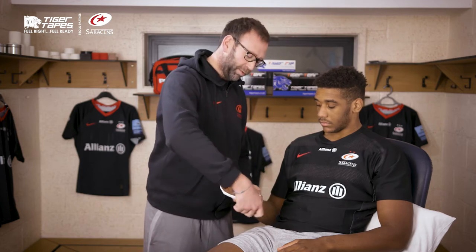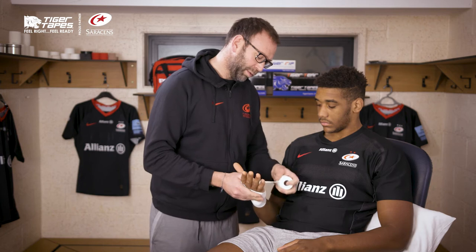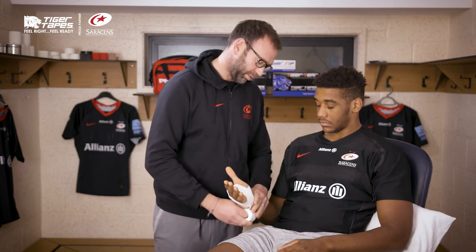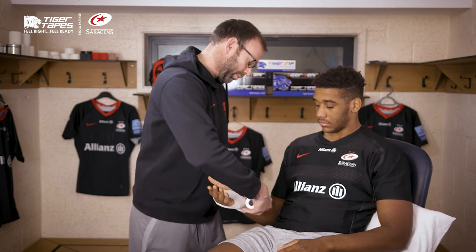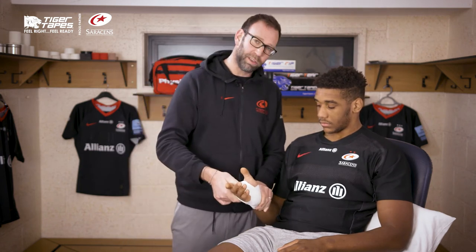If players want to catch the ball, having a flexible tape like this can be very useful. It tends to be a bit more comfortable than some of the more rigid tapes. Just lock that off, and then that gives you a bit of support.